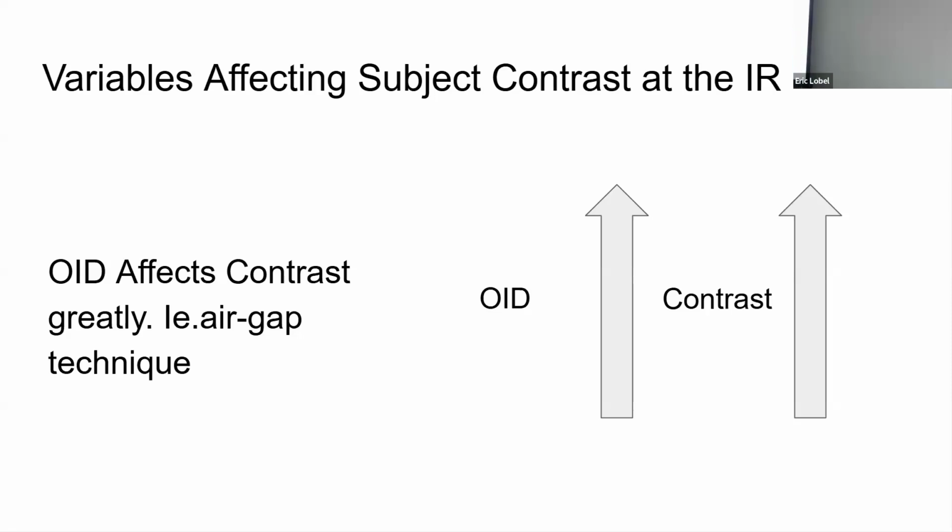Speaking of the tests that we had the other day in the lab, for not all of you, but for some of you, the biggest things I saw were not so much the images. When it comes to the images, there were some alignment issues, I think, particularly with KUB. Some of the images looked more like a pelvis than a full KUB. I don't know if it was self-collimating because you didn't put portrait versus landscape. Maybe that could have been some of it.